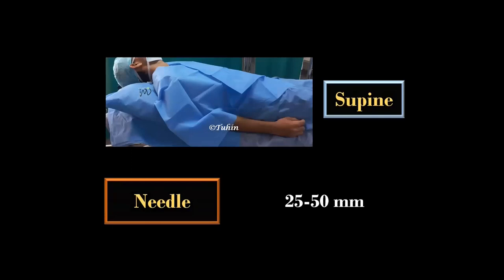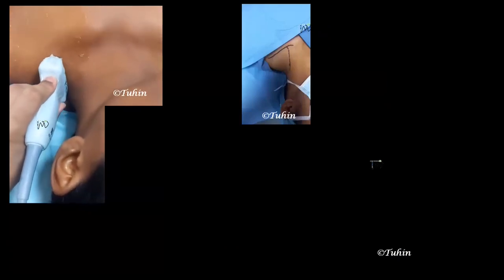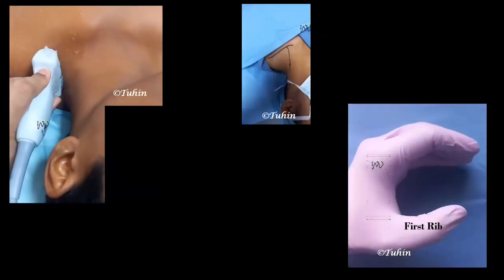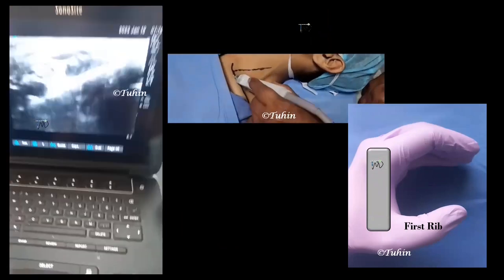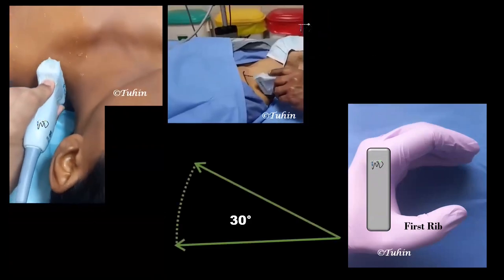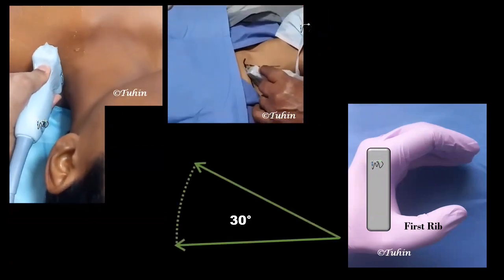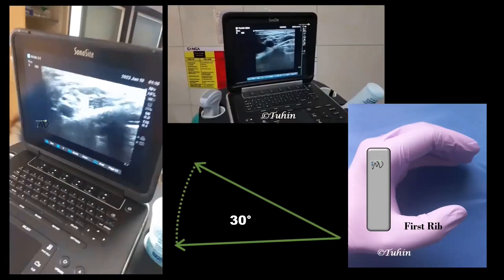These are almost similar to in-plane technique, except the supine position and a 50 millimeter nerve block needle are adequate to accomplish this block. In this approach, the probe is placed cranial to the clavicle and perpendicular to the first rib. The angle of insonation is similar to viewing the ipsilateral great toe with a 30-degree lateral tilt. Place the probe posterior to the clavicle and make a 30-degree lateral tilt — you will get a nice view of the brachial plexus.